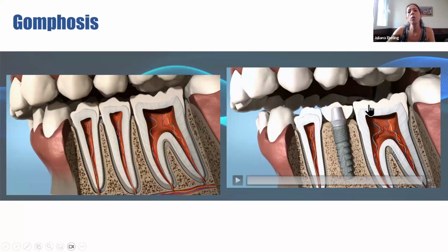Yes, because when we register with the scanners for the lab to make this crown, we don't take care of how we register this contact. For implants, we have to make this registration with the maximum force, because remember that when we make force, we will not have movement from this implant. And if I don't do that, this implant will always be high, and OccluSense will register this because I don't have movements.